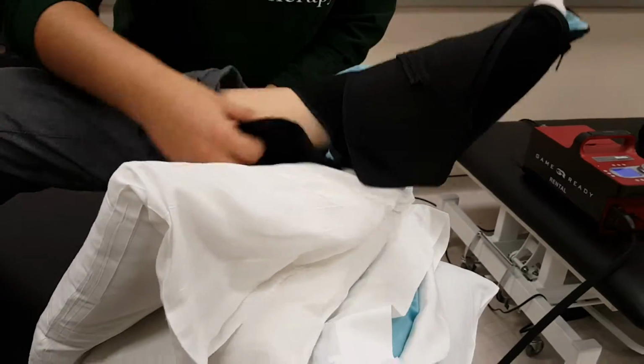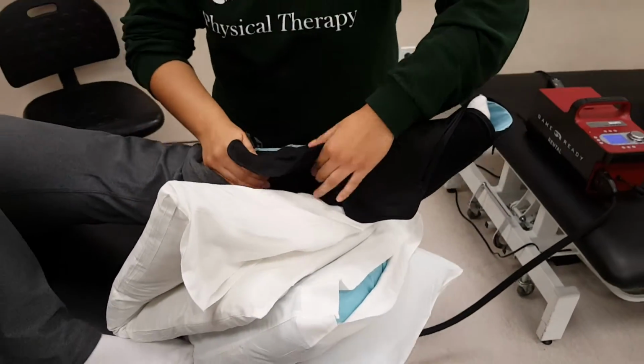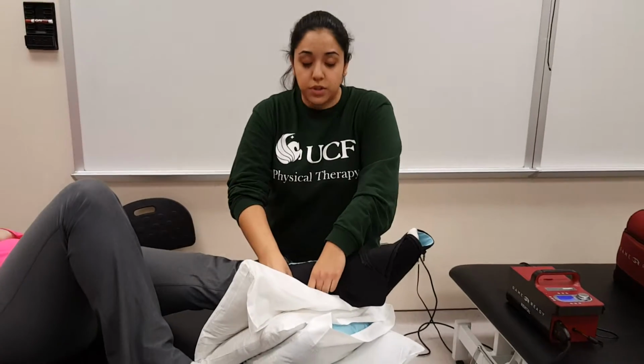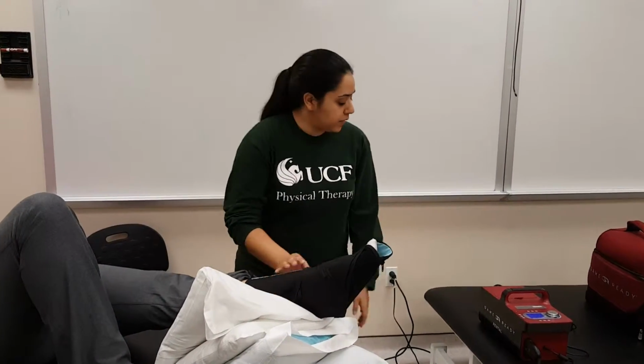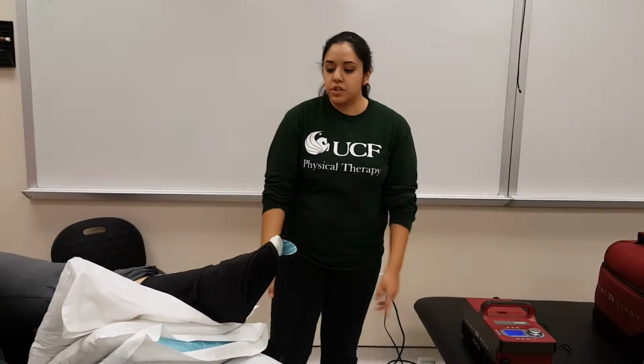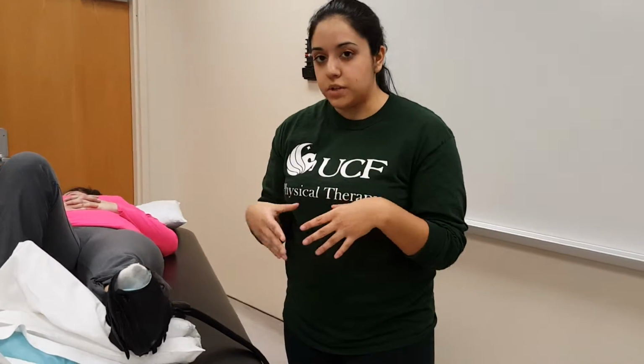Controlled cold compression therapy is good because it offers the benefits of cryotherapy as well as compression, so it will address her pain and her edema. So like this. And then when I turn the machine on, the water will rush into this cuff and fill it up and then create compression and then relaxation, compression, relaxation.